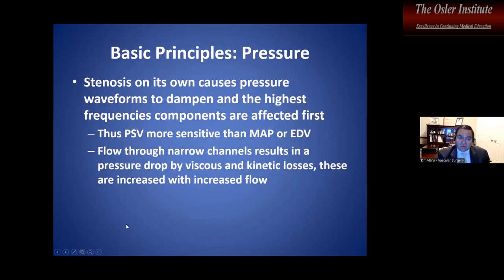Granted, I don't trust half the outside studies. If it's my own lab, I know I've got control, and I can figure that out. But when it's outside, I usually do confirmatory tests, such as a CT angiogram. It's always important to analyze more than just the numbers, whoever's reading it, and analyze it yourself. So I like to look at that peak systolic first.